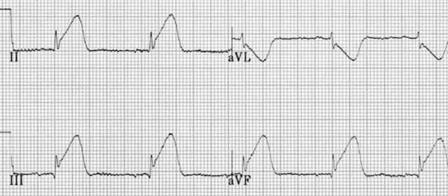And for that, you need to know a little bit about vector analysis, which sounds painful, but it's not that bad. So what an EKG really does is look at different regions of the heart from different angles with the electricity. Now, you would think that they would just label it because you put the stickers there, the right leg view, the left leg view, the right arm view, but it's not that way.